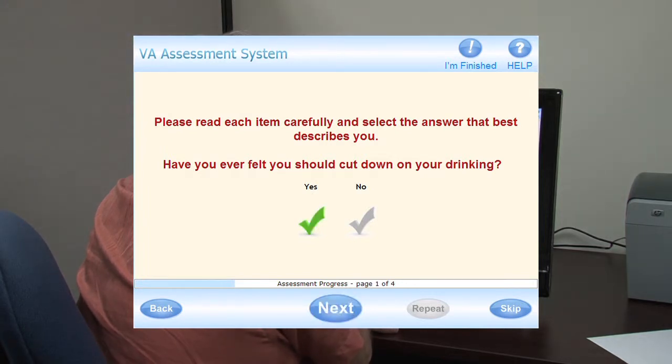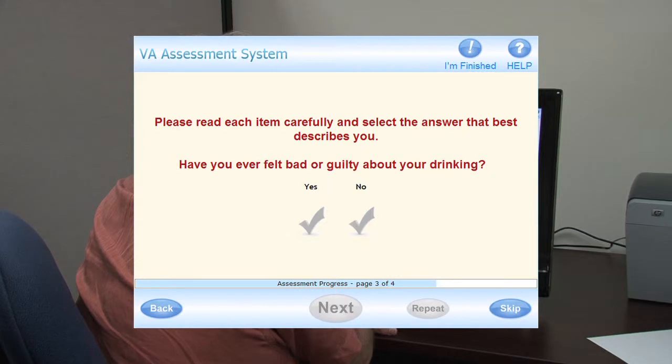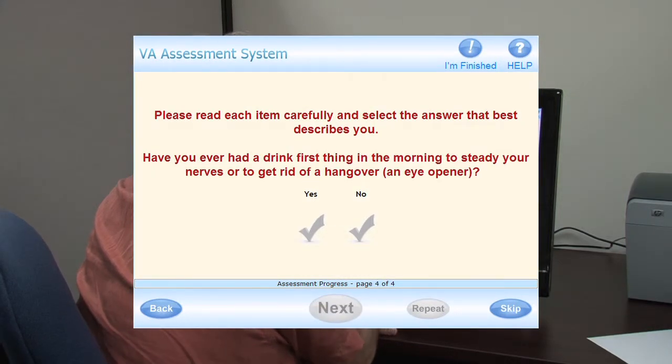The system displays multiple buttons on the screen, each of which has text and a graphic representation of the response for the button. When the patient presses a button, the response for the button is read aloud and recorded by the system. When a user has selected their final response and is ready to move on to the next page, they press the Next button. A Help button provides assistance to the user.